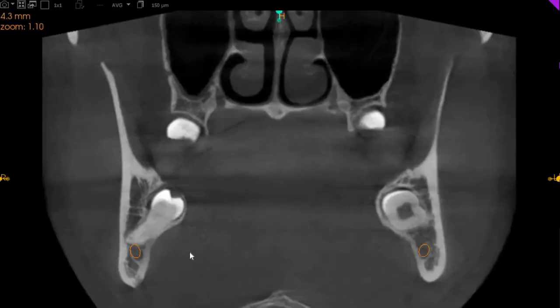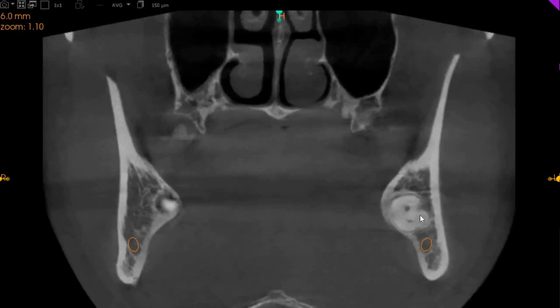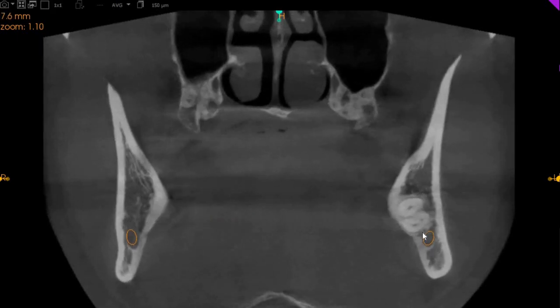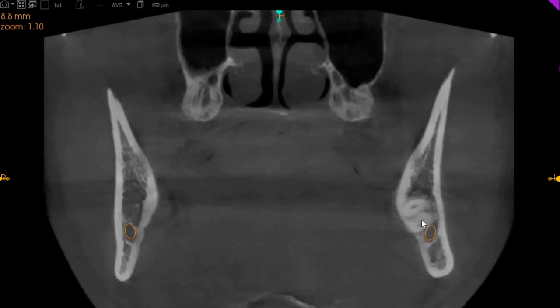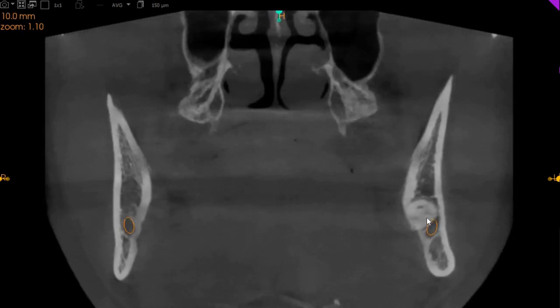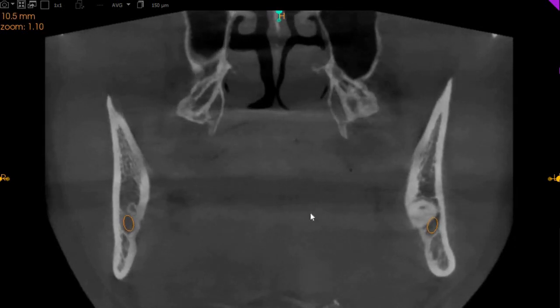Now this is the coronal view of the lower right side wisdom tooth, as you can see closely associated. And this is the coronal view of the lower left side wisdom tooth with the roots, more closely associated here. Thank you very much.